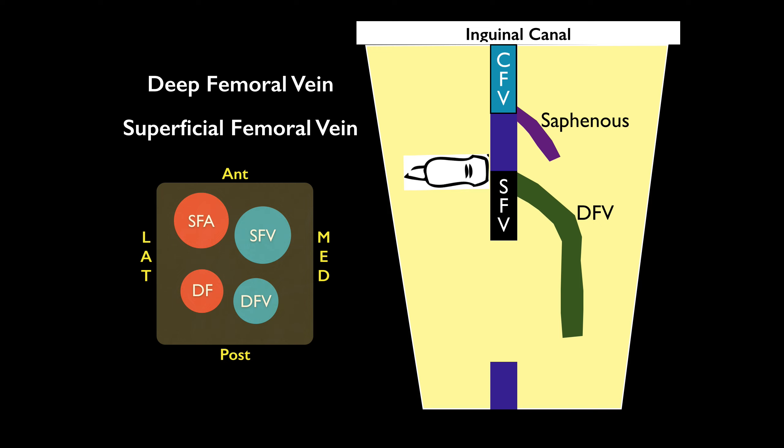Scanning a little more distally, about two to three centimeters, the common femoral vein splits into the superficial femoral vein and the deep femoral vein. The superficial femoral vein is usually anterior to the deep femoral vein. Eventually the deep femoral vein dives off and disappears, and then you continue to follow the superficial femoral vein. You want to compress both of them and make sure they're compressible.